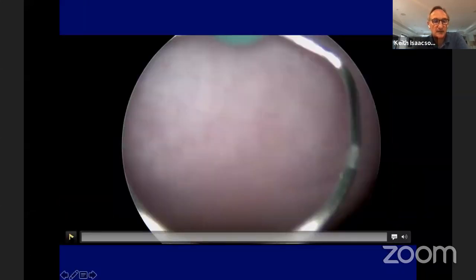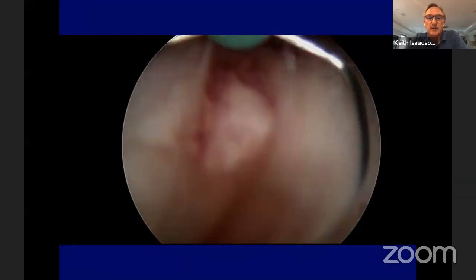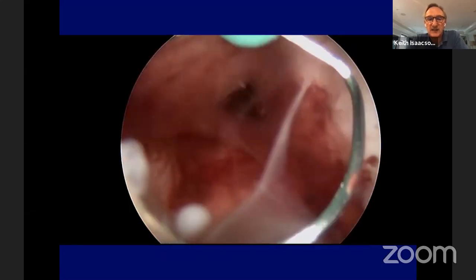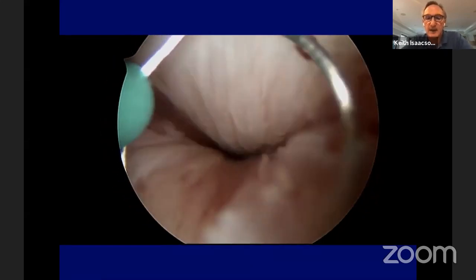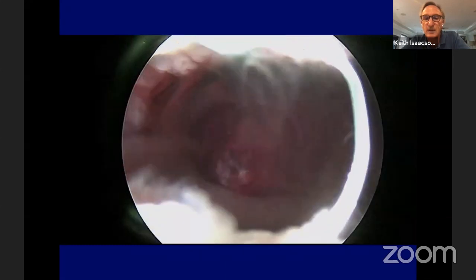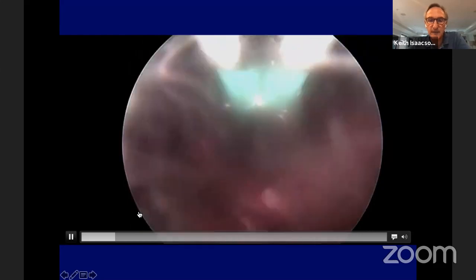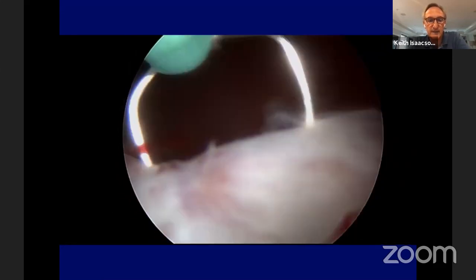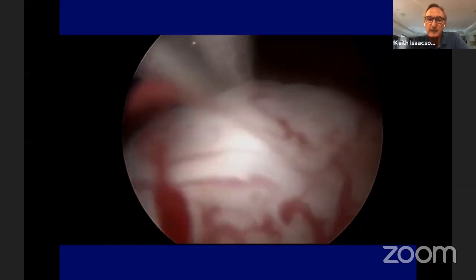This is the resectoscope. Again, understand I'm using this 5 millimeter resectoscope, again, using the vaginoscopic approach. We're not using any anesthesia. Even with that, if you cut the fibroid or a polyp with this loop, it's not painful. However, if you touch the myometrium with the loop, it is painful. So you just have to be careful using it.